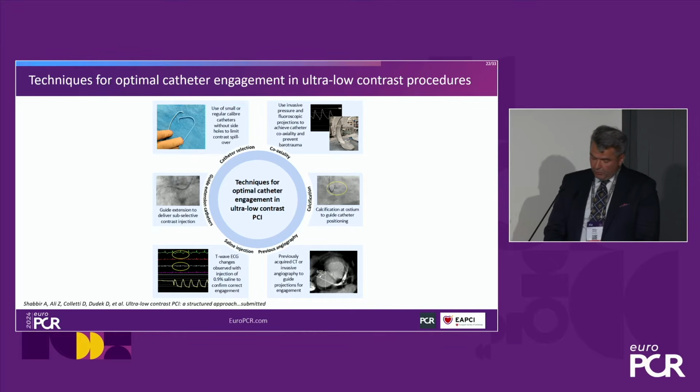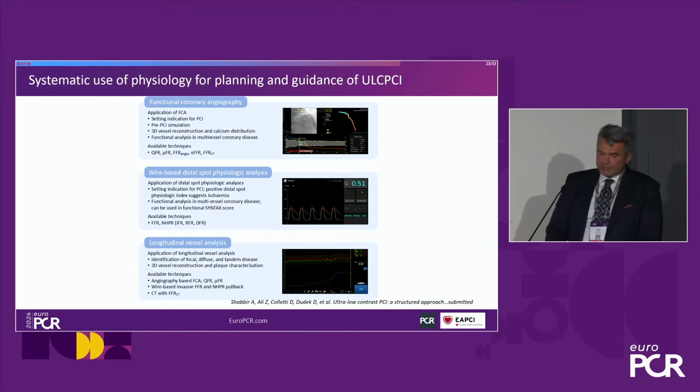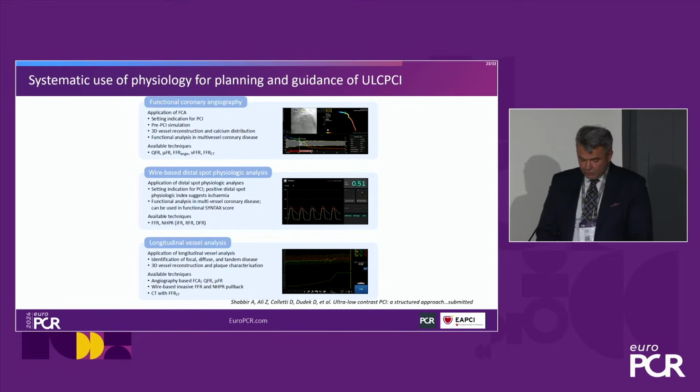to be more coaxial, how to use the calcification markers, previous angiography or previous CTA, the saline injection, as I mentioned, even in some experienced operators to use guide extension and to use catheters without side holes to avoid unneeded contrast use. Moreover, as I mentioned, technique is one, but technology is two.